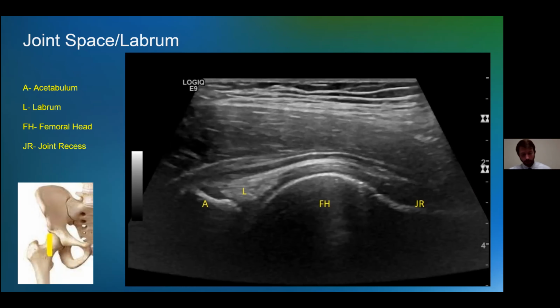As we move along, visualization of our fibrocartilage labrum. This was a nice image we were able to obtain. It's sometimes possible depending on the technique as well as the quality of your ultrasound system. So our labrum, as we recall, is a triangular hyperechoic structure at this angle. And we're going to look for areas of hypoechogenicity within the labrum. So this is the outline of the labrum here. So we're looking for areas of hypoechogenicity that might suggest any tearing or fraying or any free fragments.